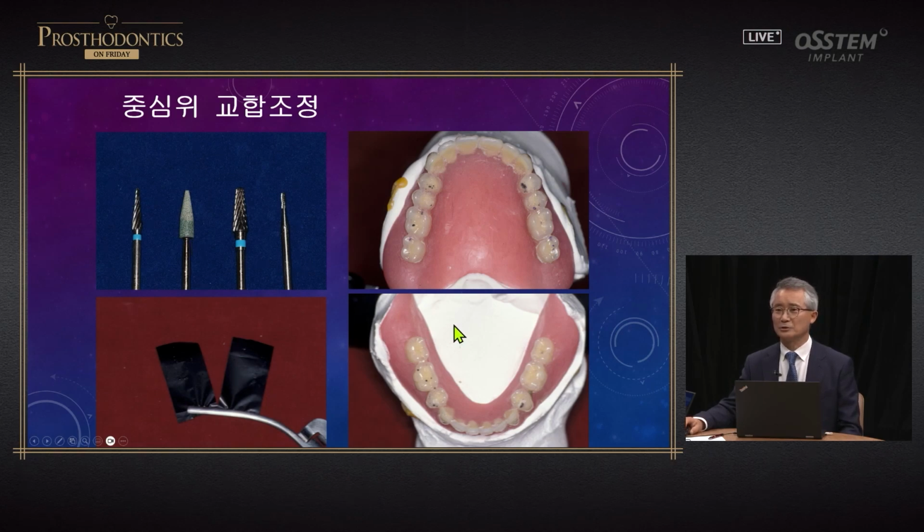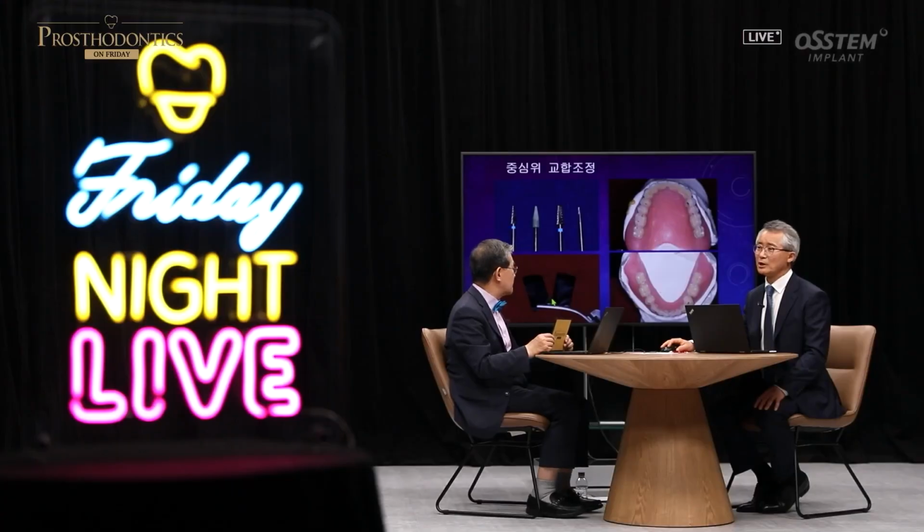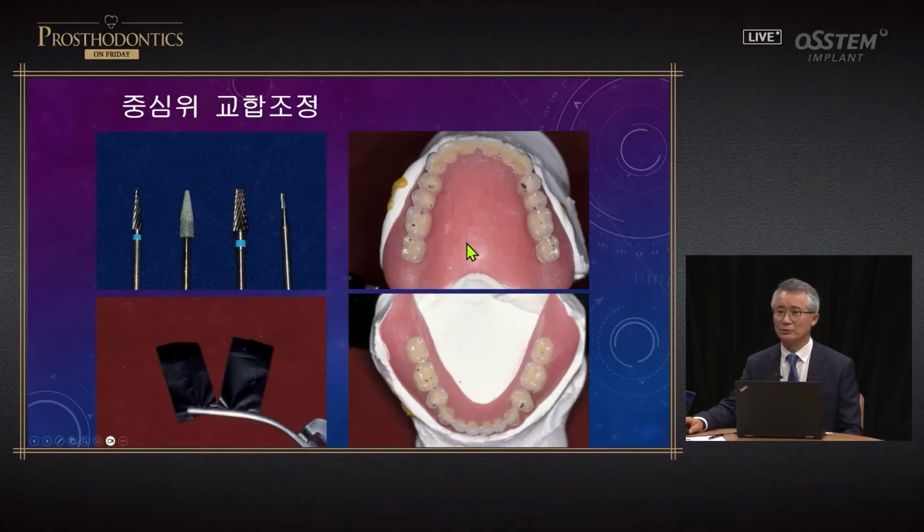It's black on both sides. It's marked. For articulating paper, I use Acufilm. This is about 20 micron, about 23 micron thickness. I use the Acufilm used for crown and bridge restorations. I do not use the thick ones. I think it's very important to use this.